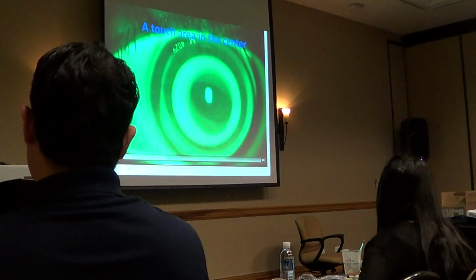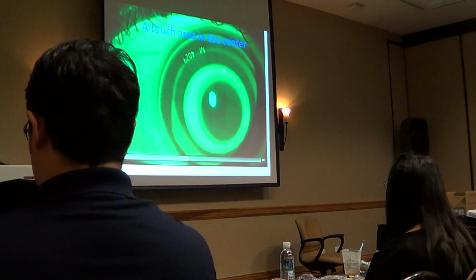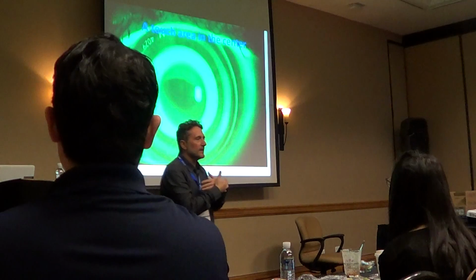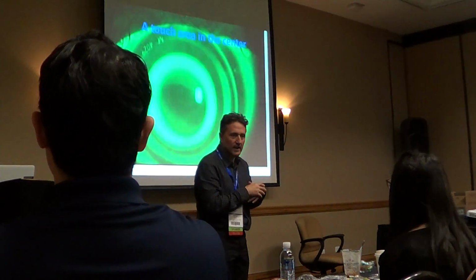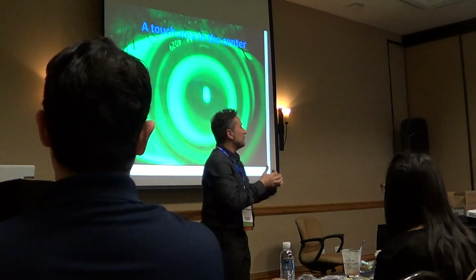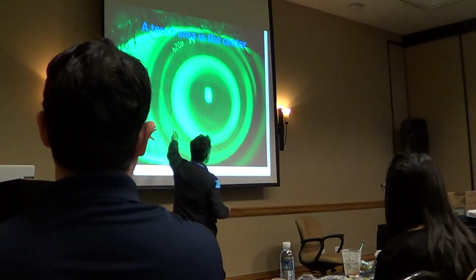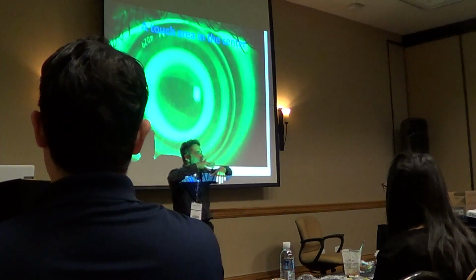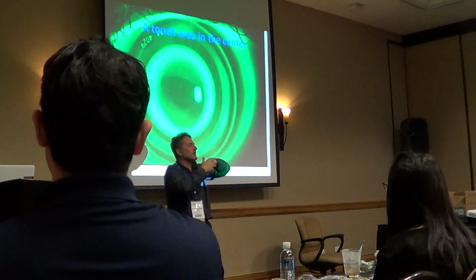This is very clear. The lens is good. You could provide the lens, but you have no tear film under the back optical zone of the lens. So you could have some contact there, and because the lens in this area is not well aligned, because maybe you have some toricity, the lens will move around all the time.